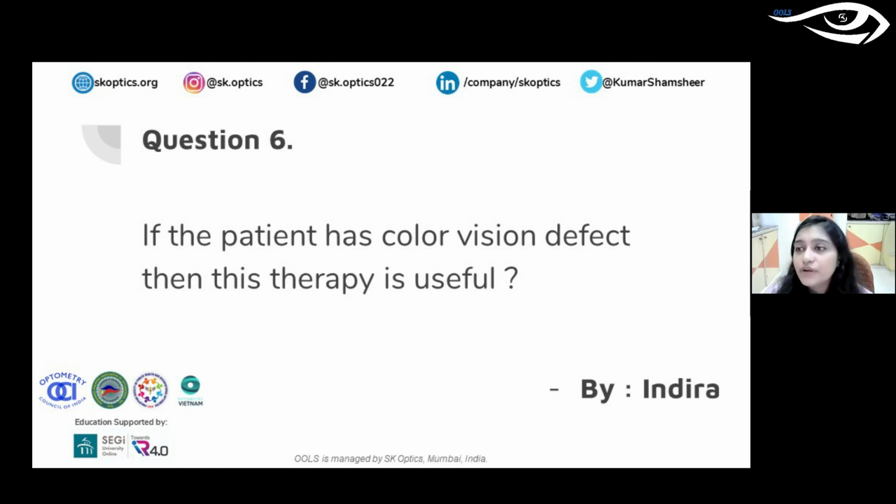Yes. So what you can do is give them scleral lenses or RGP lenses, Kerasoft or whatever. Give them the best treatment available for their keratoconus, and then you can start therapy on Binocs. So you can use Binocs for this patient, even though there's an underlying cause. But of course, you have to take care of that cause.